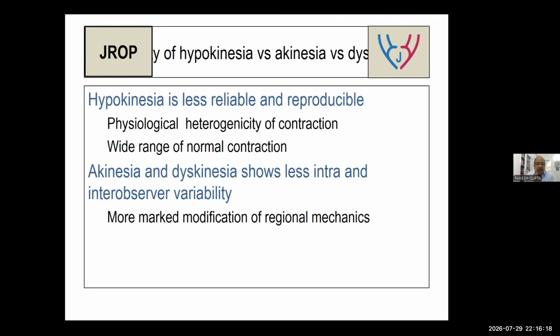So when we talk of wall motion abnormalities, segmental, specific coronary disease, apical aneurysms are related to coronary disease or Takotsubo. Or you can have reverse Takotsubo, where the apex is preserved and the basal segments become ballooned out. So all these things go hand in hand with history.